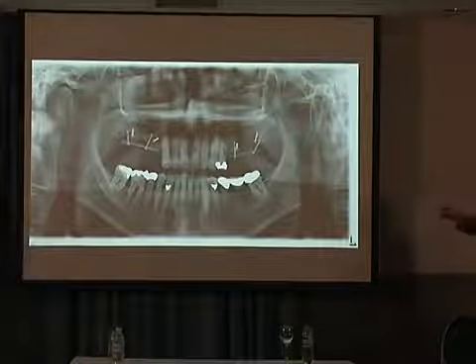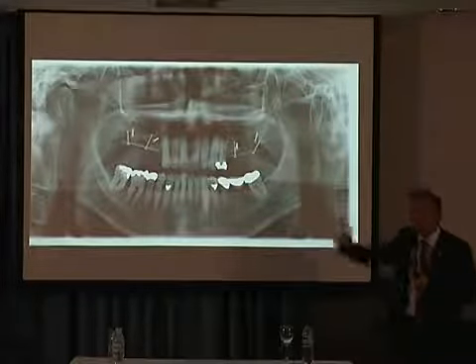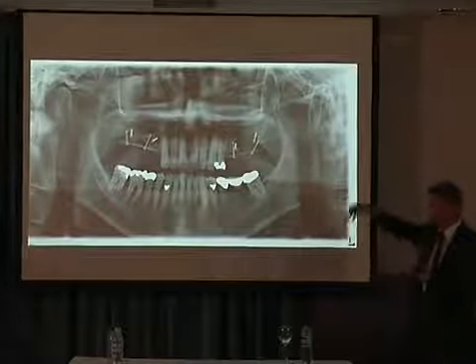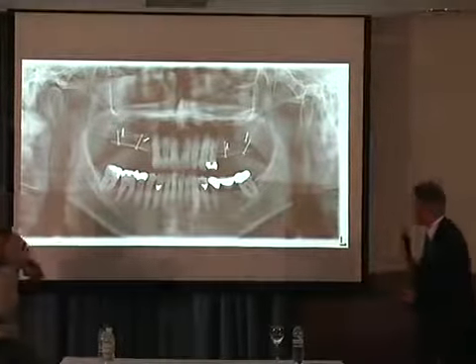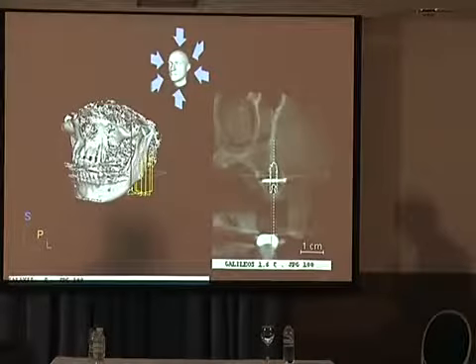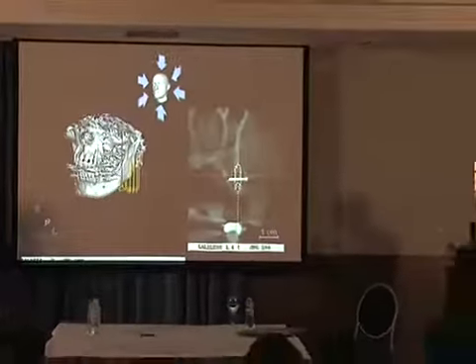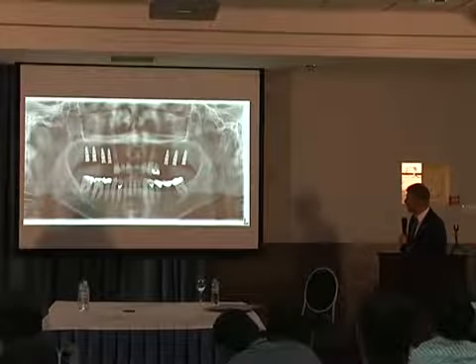No granular, only blocks to come faster after 3 months with the implants. No granular, only blocks. Окей. Никаких гранул, они не размалывали, только блоки. Были сделаны блоки, чтобы побыстрее наступила регенерация. X-rays 3 months later, 3-dimensionally. Через 3 месяца имплантаты были размещены.